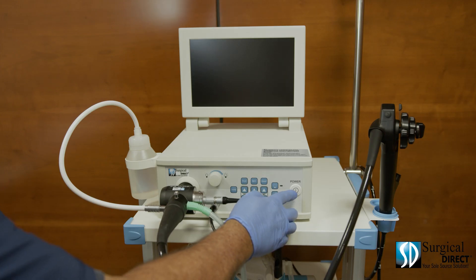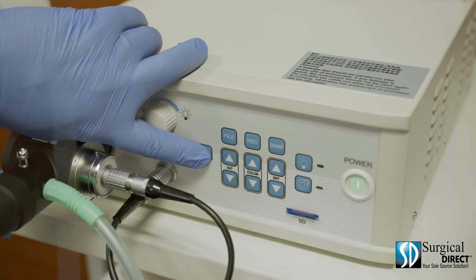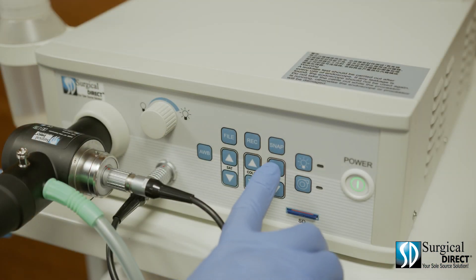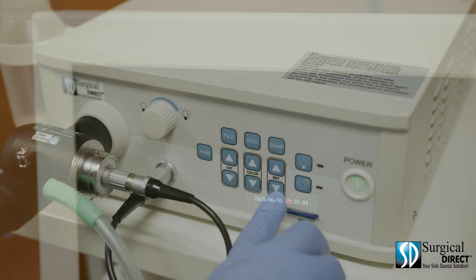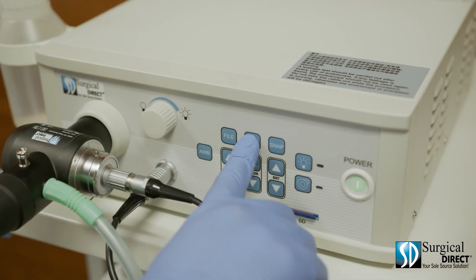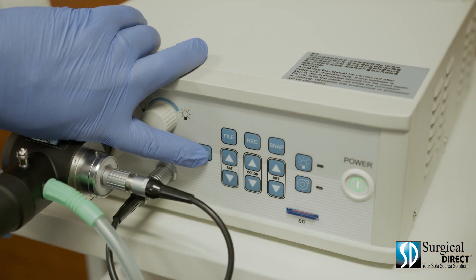To turn on the system, simply push the power button. You'll want to set the time when you receive your system. Press and hold the automatic white balance button. From here, you can adjust the time. Using the up-down brightness arrows, you can toggle through the time and date menu. By pressing snap, you can adjust the time up; by pressing record, you can adjust the time down. To save, press the automatic white balance again.